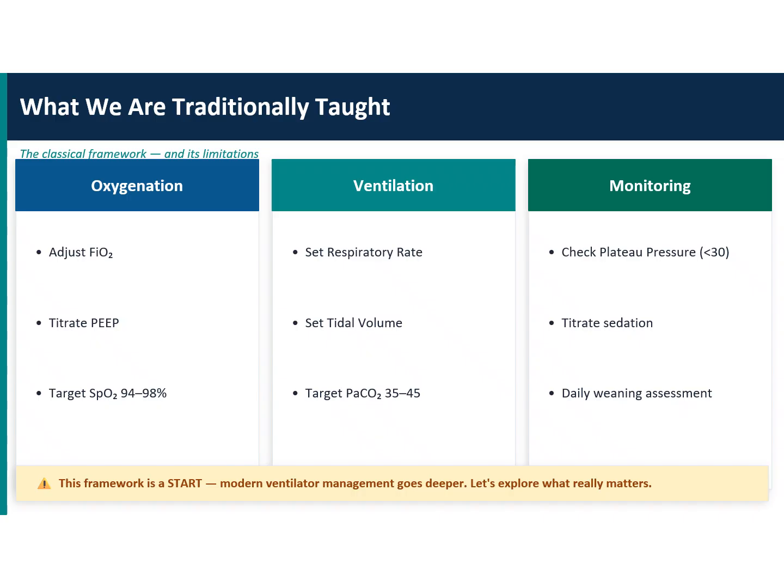All the studies, irrespective of whether ARDS or not, even in patients with neurological illness, when you intubate, you want to target a tidal volume of not more than 8 ml per kg. When you want to wash out CO2, that's what we call bedside, you want to increase the respiratory rate. So for ventilation, you require respiratory rate and tidal volume. For oxygenation, we require FiO2 and PEEP. And we have to monitor the plateau pressures.